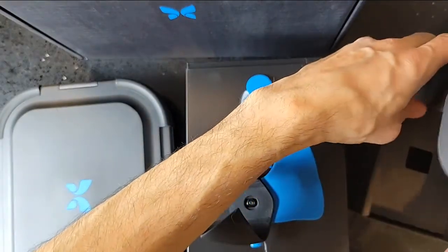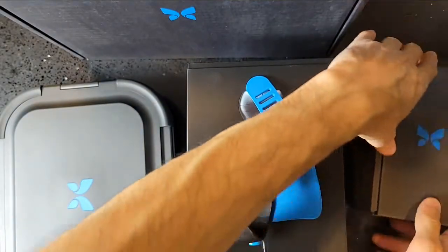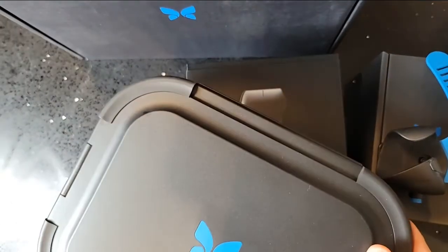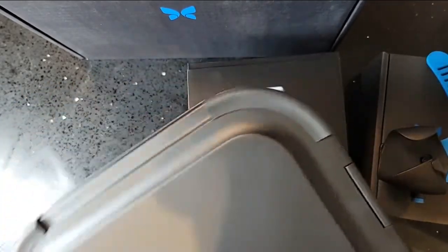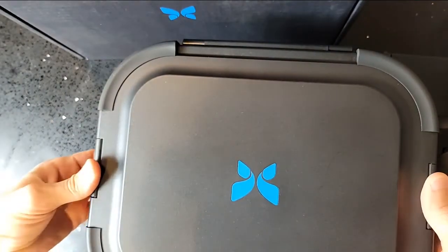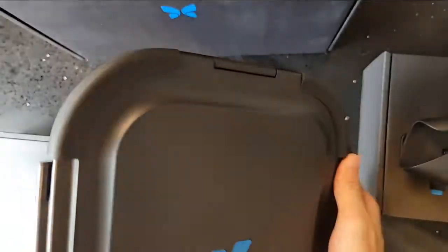Moving over to the case on my left — I decided to get the carry case because if you're going to spend money on something as expensive as this ultrasound device, you might as well get a case. It just doesn't make sense not to invest in it. Same way they say invest about 10% of the price of a bicycle on the lock — I felt this portable case was important for that purpose. Opening it for the first time — there's a handle on the side, which is great for portability.